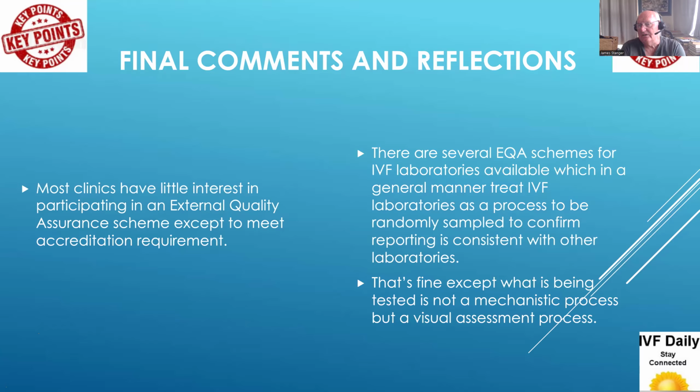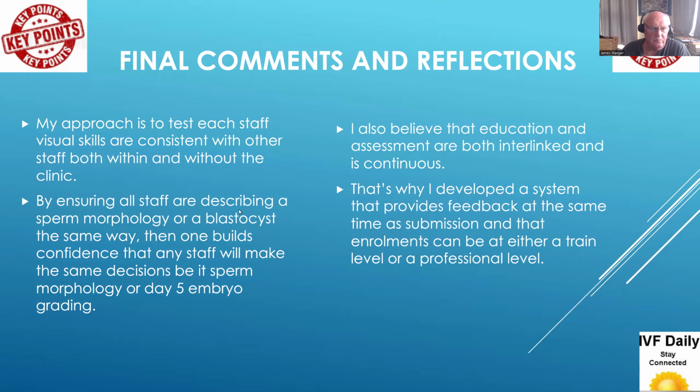That is how an industrial-based EQA program works. That's fine, but what's being tested is not a mechanistic process, but a visual assessment process. My approach has been to test that each staff member's visual skills are consistent with each other, both within and outside of the clinic. And my argument is that by ensuring all staff are describing a sperm morphology or blastocyst the same way, then one builds confidence that any staff will make the same decisions, be it sperm morphology or day 5 embryo grading.